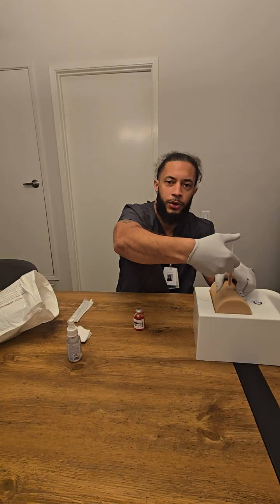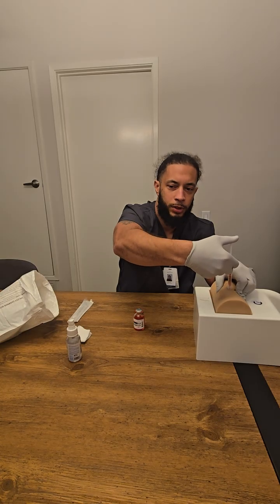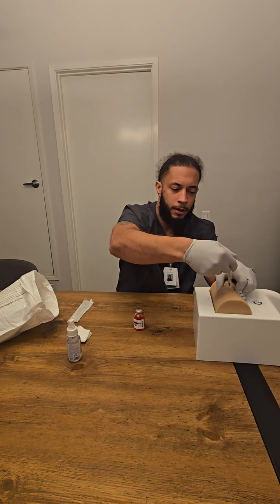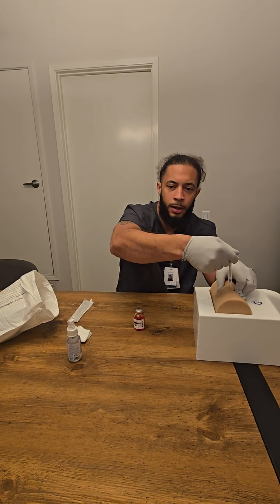We keep holding for 30 seconds. And then we remove.